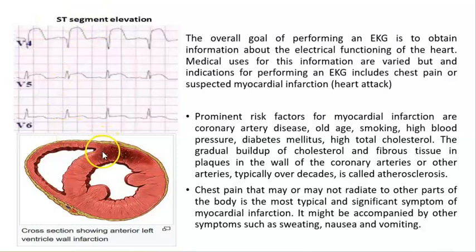As you can see right here, part of the ventricle is dead, and that most of the time is associated with an ST elevation in the electrocardiogram.